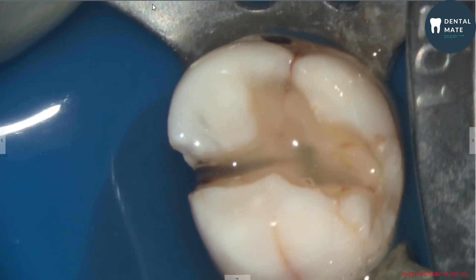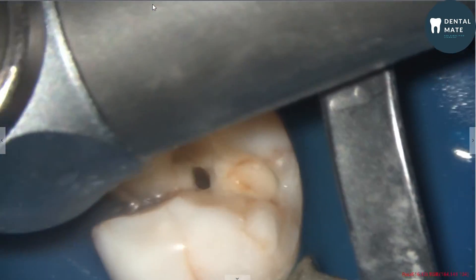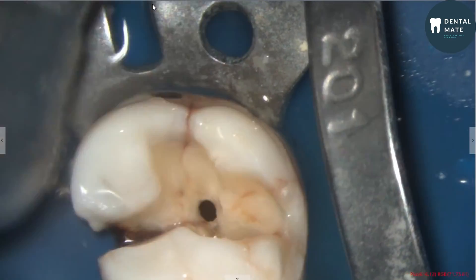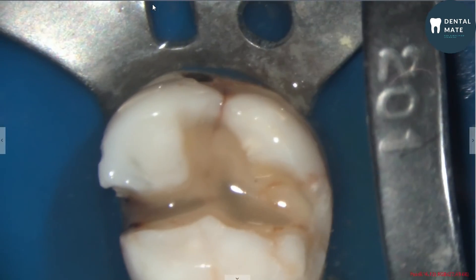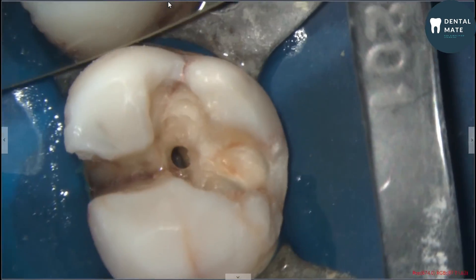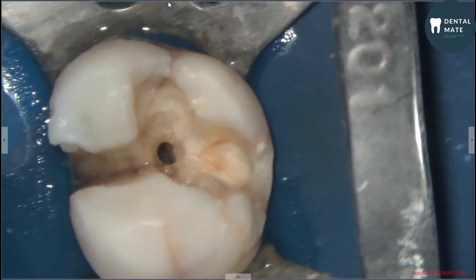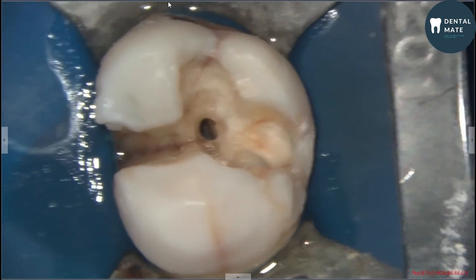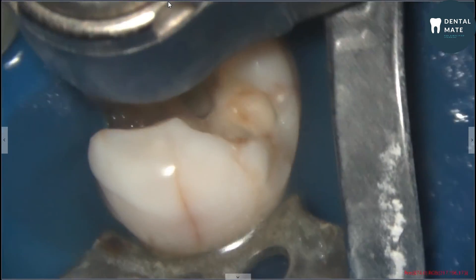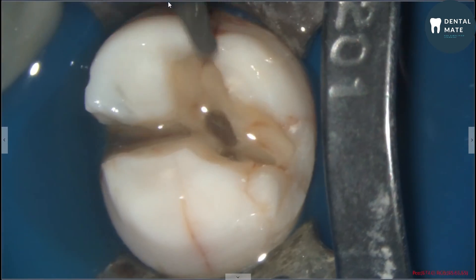While removing the caries, I got the first burr drop. We will not progress with this burr drop to de-roof the pulp chamber yet — we first attain a caries-free peripheral seal. Now that all caries have been removed from the periphery, we'll switch to the safe-end EX24 burr, which has a non-cutting tip, and start de-roofing the pulp chamber in a lateral cutting motion.